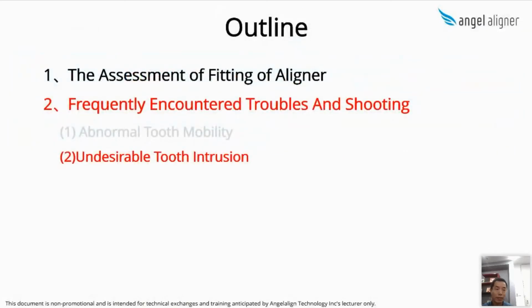Okay, we come to the second trouble, undesirable tooth intrusion. The common cause of undesirable intrusion is lack of space. As we know, force plus space makes movement.